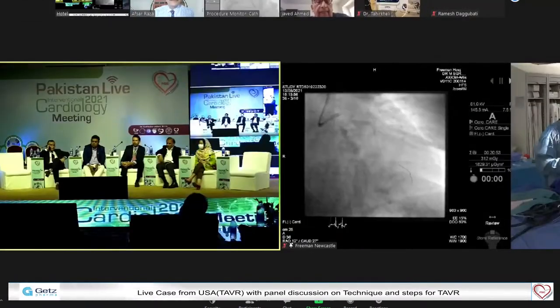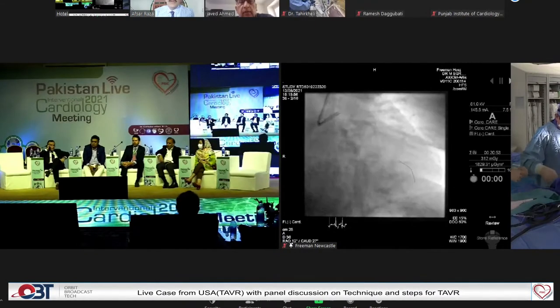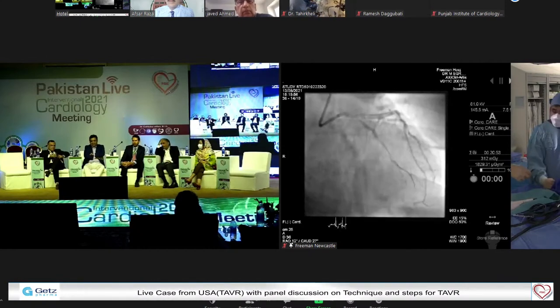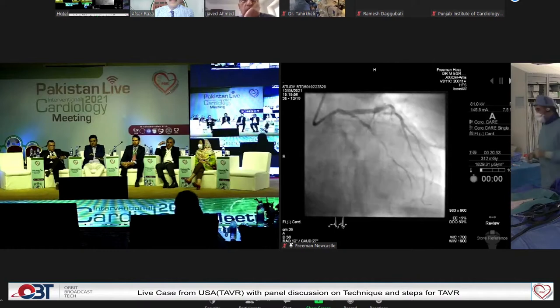Yes, thank you. Okay. All right, I'm going to take the final picture. Let's show you that, and then we can have further discussion about it. You got 512, give me 30 frames. All right. So let's just collimate that and take a look at it really carefully.